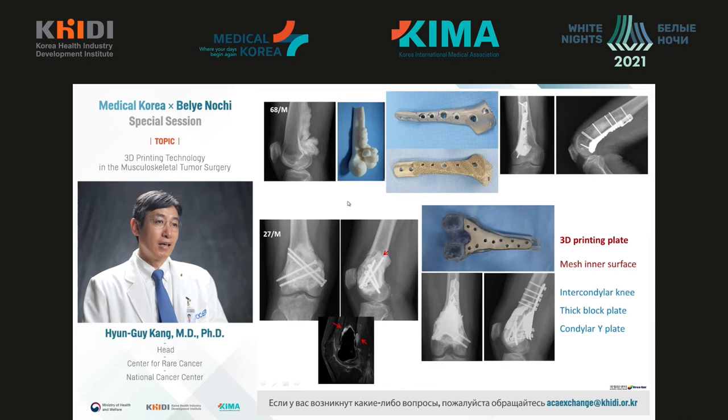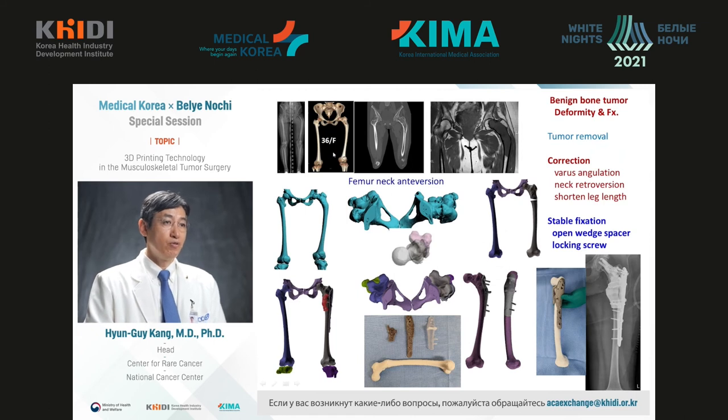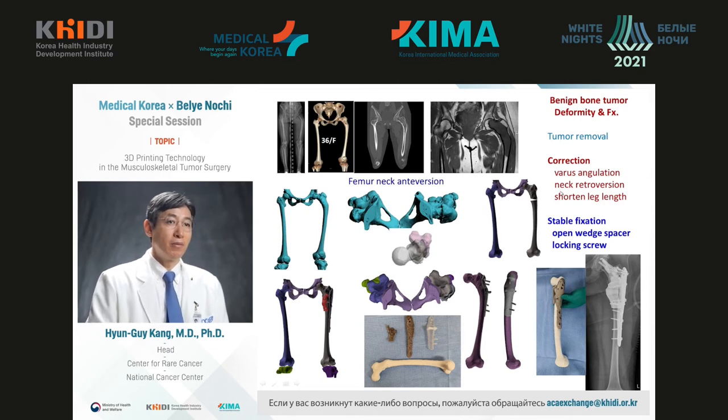A male, 68 years of age, and another man, 27 years of age. Diagnosis: tumor of the distal part of his femoral bone near the knee joint. We can use the block with a plate, or we can make an intercondylar plate.